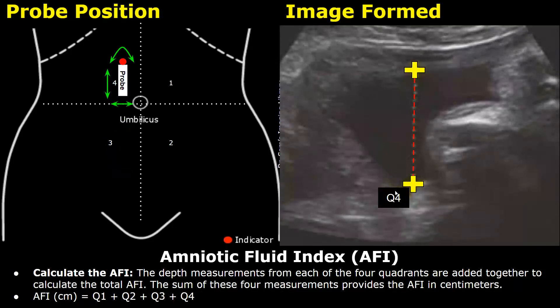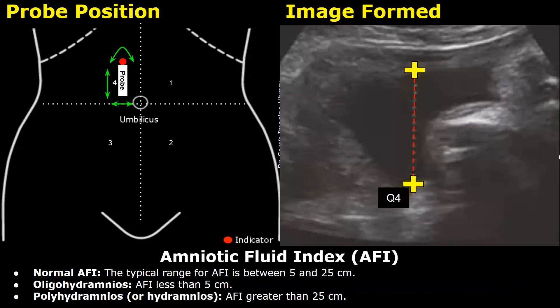Finally, take the measurement in the fourth quadrant, which is the right upper quadrant. After you have four measurements from all four quadrants, you can add them together to get the amniotic fluid index.